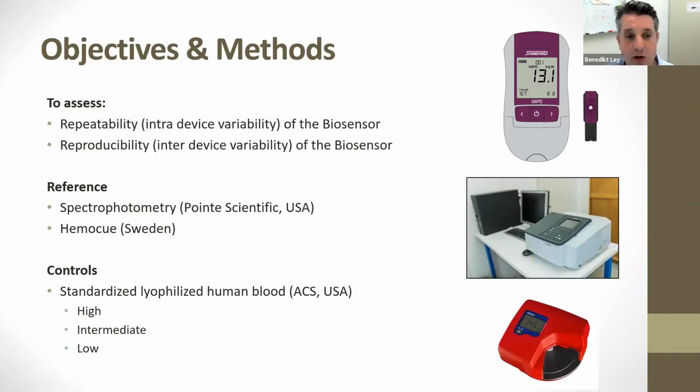So in collaboration with Rosalind Howes from FIND, we developed a protocol to assess how much results would differ if the same sample was tested by the same machine repeatedly, but also how reproducible results would be when the same sample was tested by different machines. In both cases, we would compare the biosensor results to spectrophotometry using assays from Point Scientific, as well as comparing the Hb readings to measurements from a HemoQ.